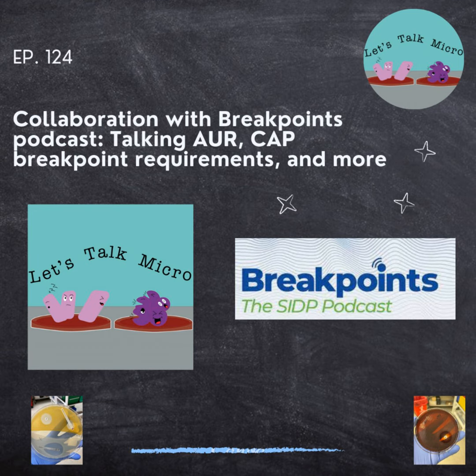So those in the audience that are listening, if you're a medical lab scientist, if you're running some sort of molecular test where you get one of these markers, like mecA, vanA, when you have your final report, you have an actual organism. A great example would be vanA is detected, and then your final report is vancomycin-resistant Enterococcus. So those are the three.